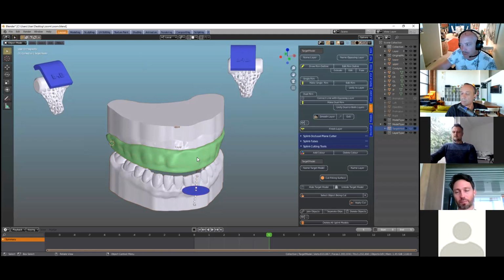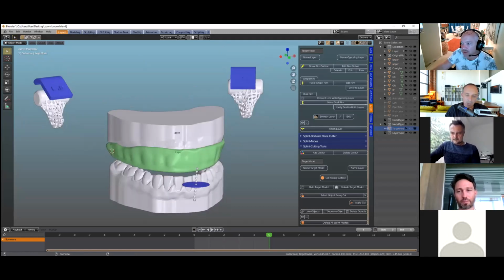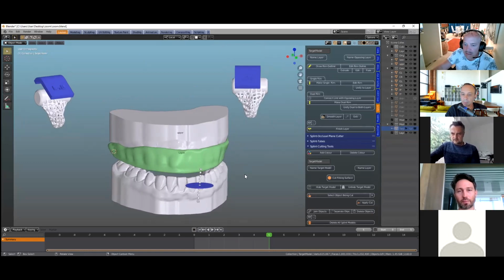I think that sort of concludes it. I've gone very deep in depth. We haven't discussed the making of the blockout, how you can sculpt the undercuts. Very important if you've got maloccluded or overcrowded teeth. You may want to look at sculpting the undercuts.